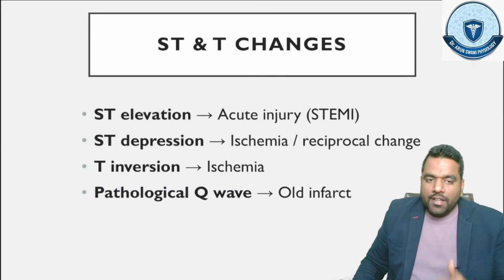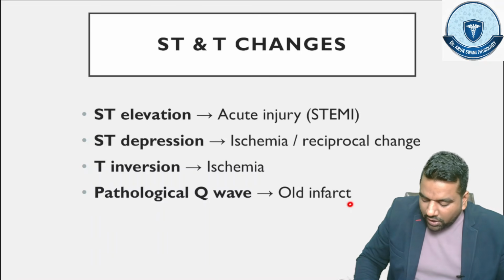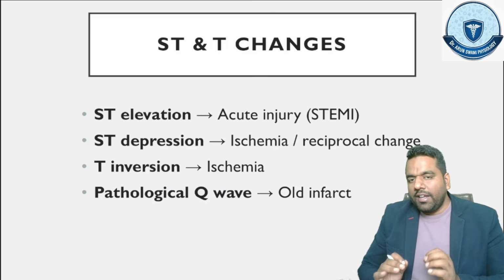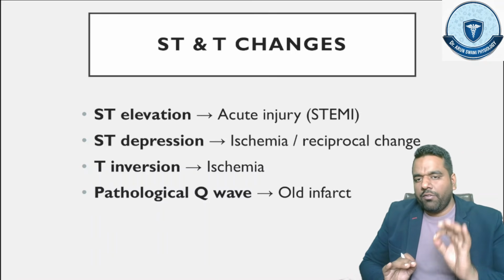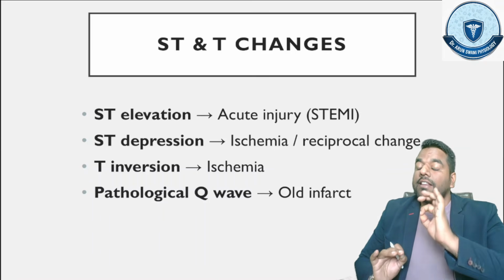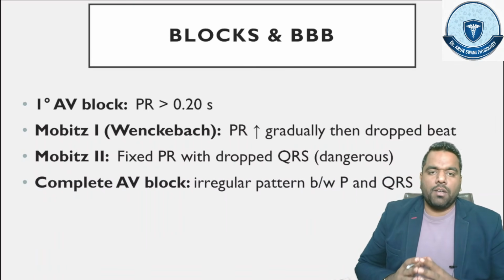Guys, please pay attention. The pathological Q wave is defined as the old infarct, right? Old infarct. Okay. So this is how you have to easily understand and easily remember with relation to the ST and the T wave, right? Very, very important. The next part is blocks and the bundle branch block.